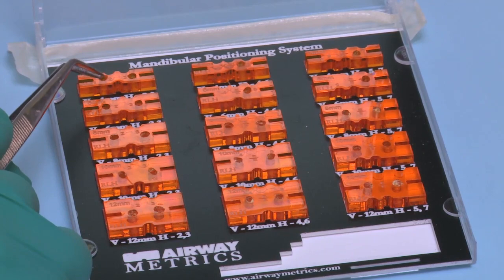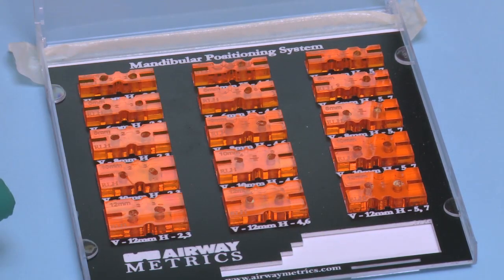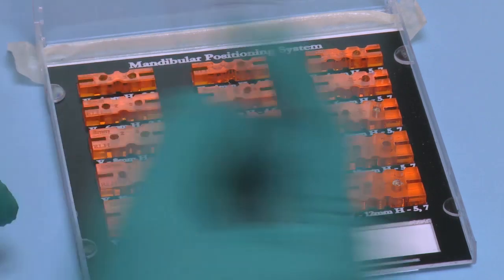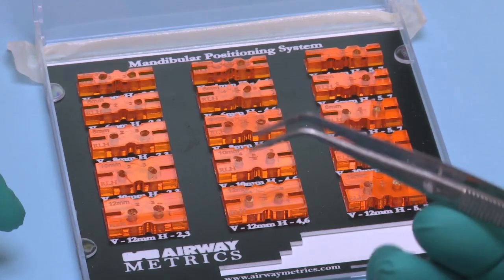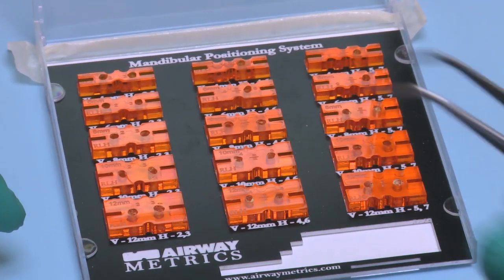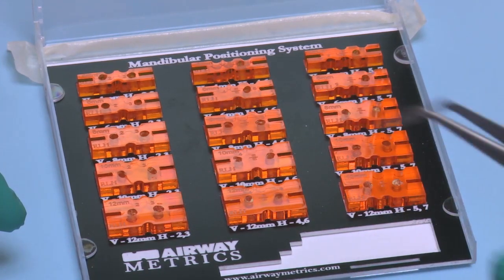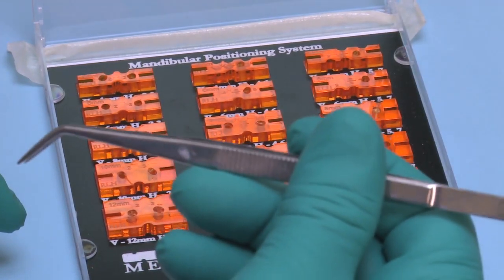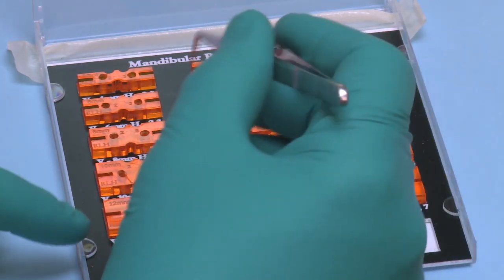That's why there's a 4 millimeter key. Let's start at 6 and see what happens with Kim. And I always start 6 edge to edge because less is more. I can always move my appliance forward. You can't move the appliance backwards. They all have some type of an advancement mechanism, and we'll look at that shortly.